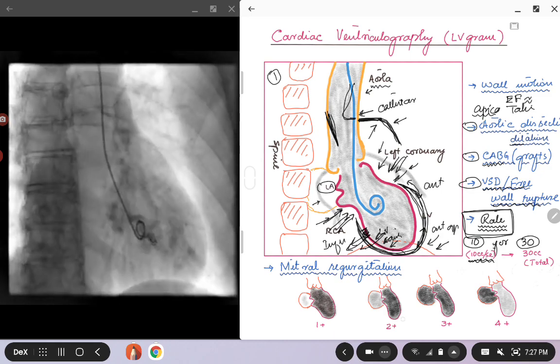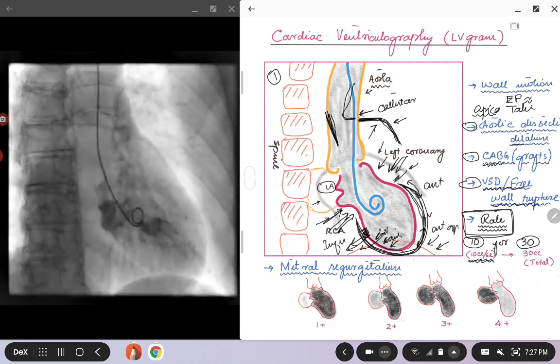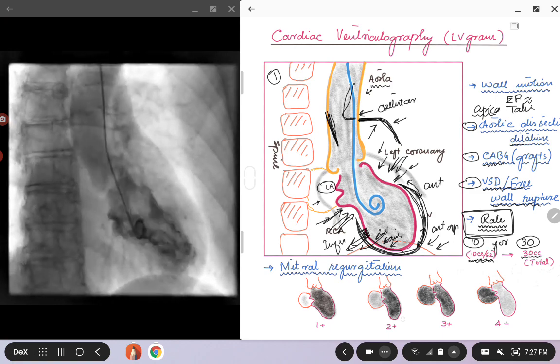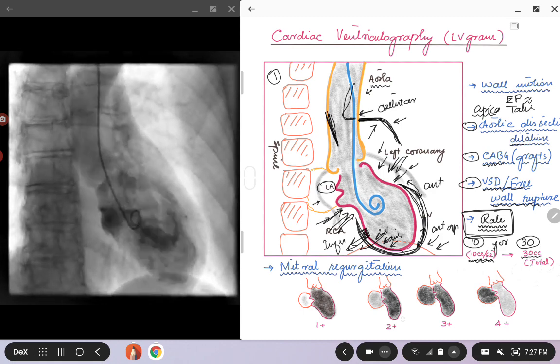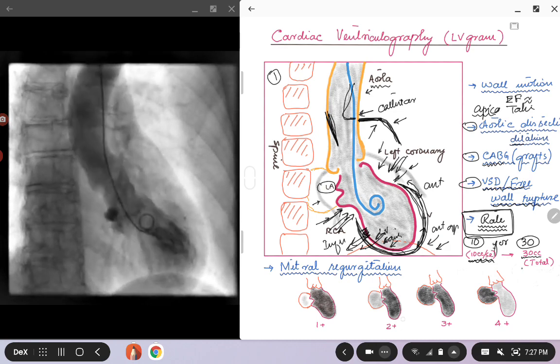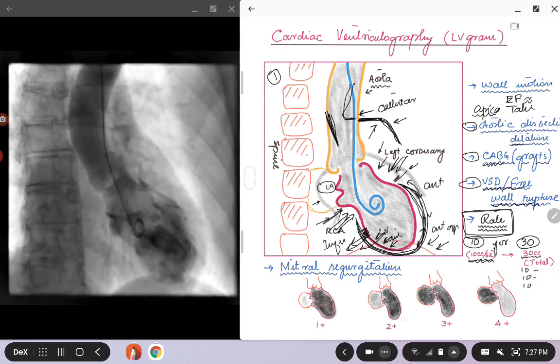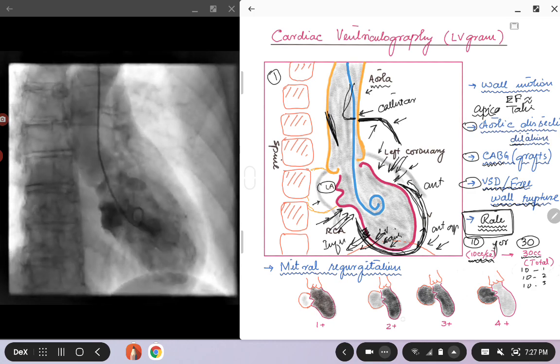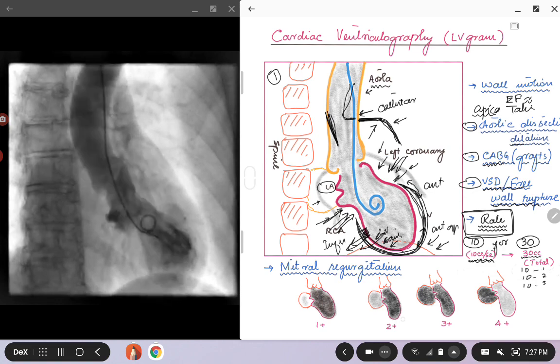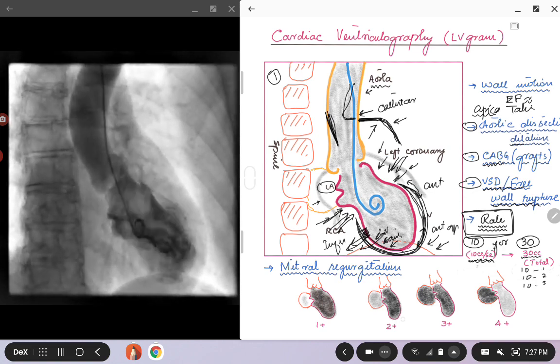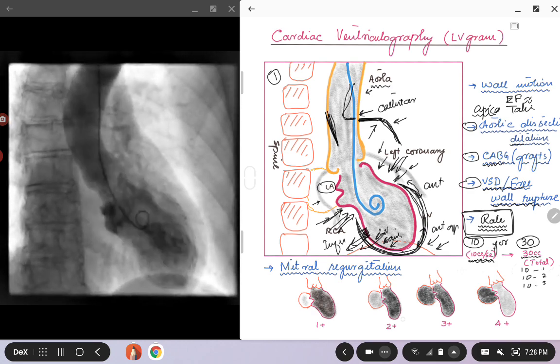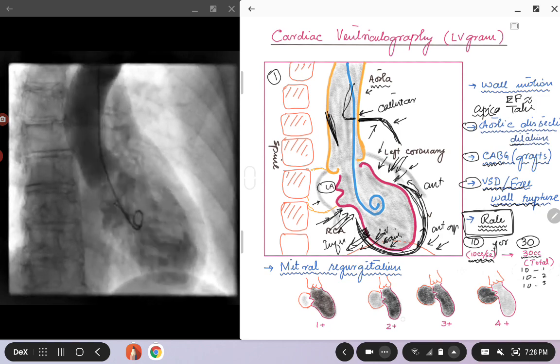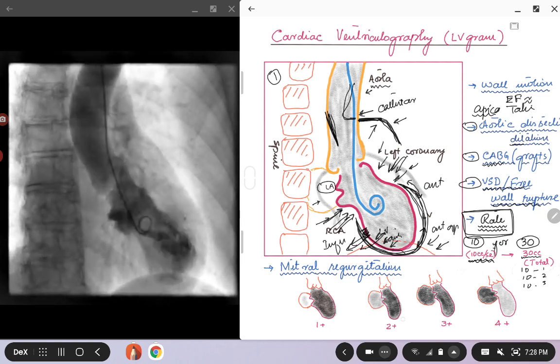The second number — 30 — is the total volume of contrast you want to give to the patient, so 30 means 30 cc. The power injector will inject 10 cc in the first second, 10 cc in the second second, and 10 cc in the third second — basically 30 ml in three seconds. Depending on how much information you want or how big the patient is, you can choose accordingly. Also, if the patient has renal dysfunction you want to minimize the dye load, so you go for the lower settings in those patients.